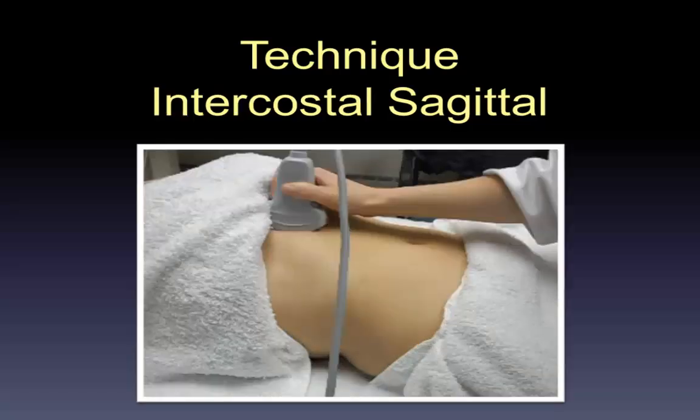Say that view doesn't work that well. Sometimes the gallbladder is a little higher than expected, so you just move up above the costal margin and try to image it in between the ribs. Again, deep breaths may help. Once you identify it, again, go for some long and short axis views of the gallbladder. Make sure you see the other landmarks that are there.